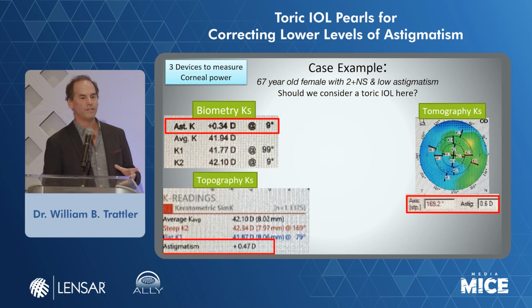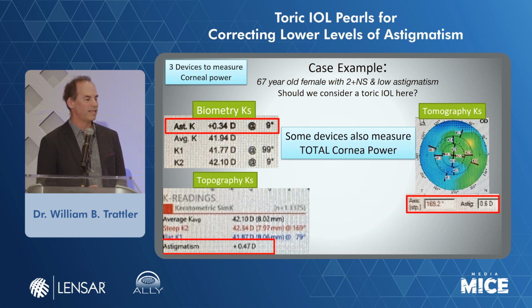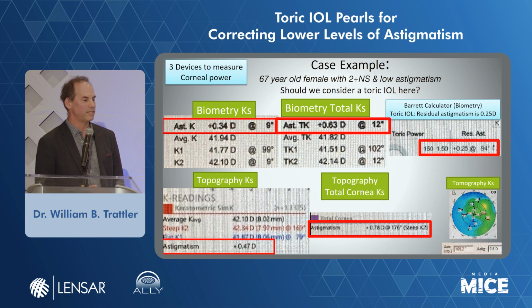But the key is that we have 3 different devices, and that's always a challenge. They don't always say exactly the same thing. So here's a patient in our registry, and with the Master 700, her Ks were 0.34 diopters at axis 9. Okay, the topography was 0.47. The Pentacam was 0.6. This is all anterior astigmatism. You can see the topography doesn't look great. It's a little bit irregular, but again, when you have horizontal astigmatism, we know from the nomograms we're going to have to add. And then also to look at the total corneal power on the 2 devices, both the Cassini and Master 700 showed a little bit more, 0.63 and 0.78.